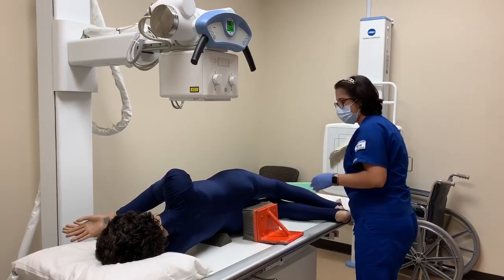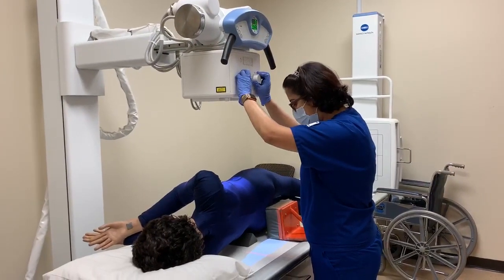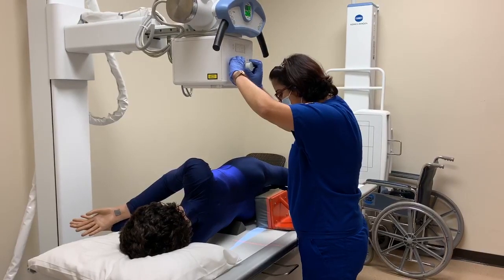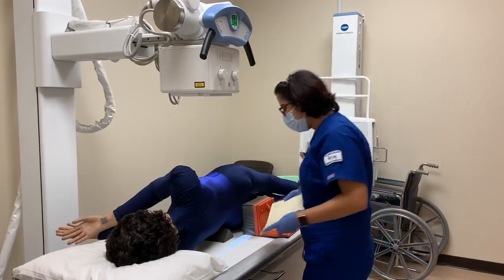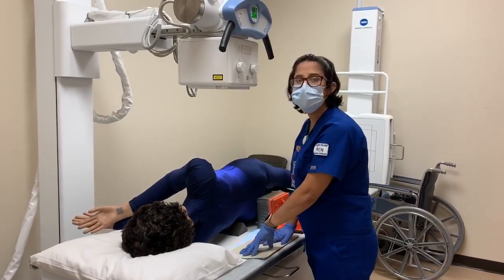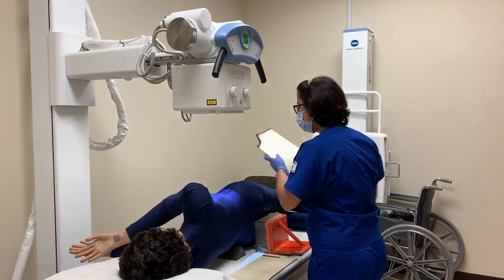Following up with that, we're going to check our collimation, collimate down, tighten it up a little bit. Along with that, we use a lead backing just to help pick up some of the scatter that's going to come through. And then shield your patient.